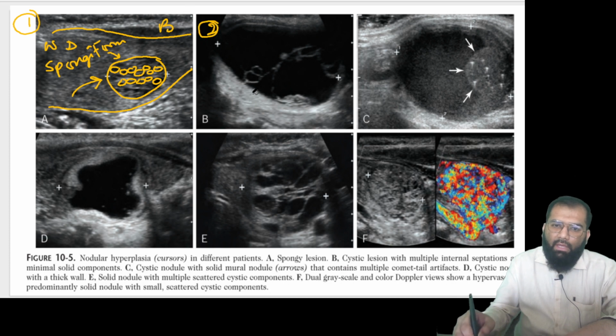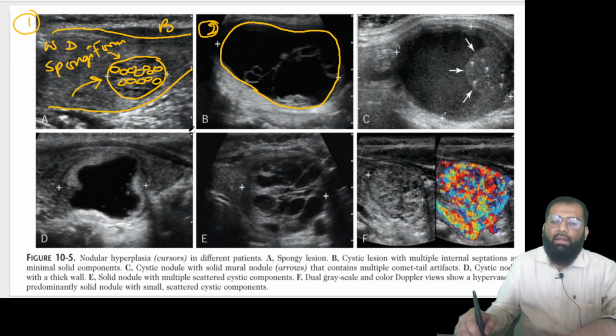Number 2. So now in thyroid, you are able to see this well-defined lesion, which is a nodule, a well-defined nodule. Okay. Now, और क्या दिख रहा है? See, can you see that this is anechoic? What do you mean by anechoic? It means it is completely dark and you are able to see this posterior acoustic enhancement. I've talked about this in my previous session. What is posterior acoustic enhancement? You compare this region with this, so that means that this is a cyst.